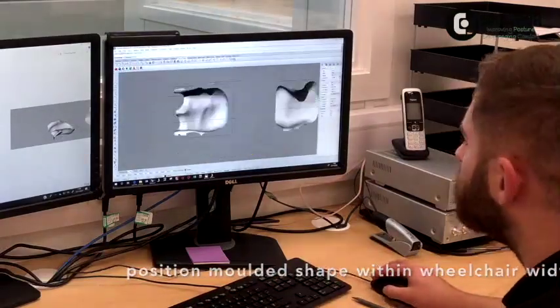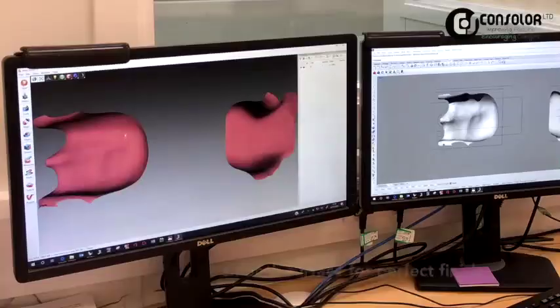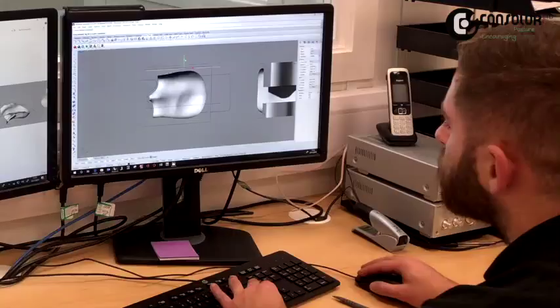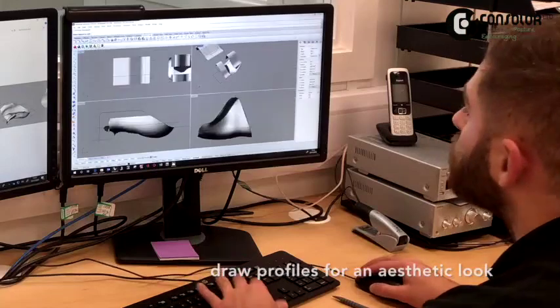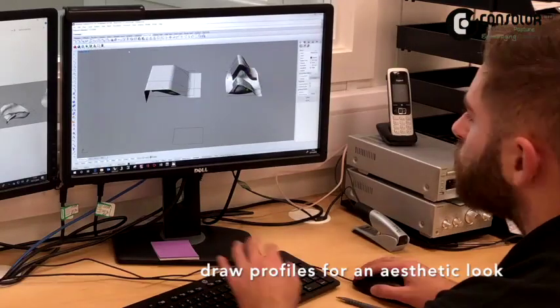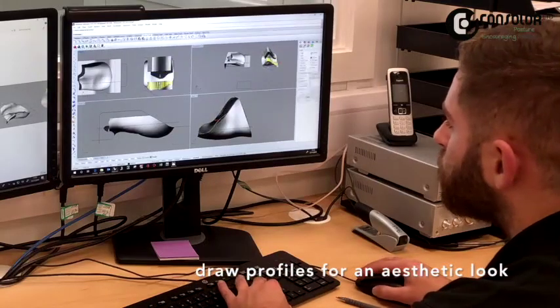Treating them as separate cushions speeds up the robotic carving process and reduces the amount of foam waste. The seat surfaces are smoothed and external profiles finalised to make the seat look as good as possible. How the seat will fit into the wheelchair for size and orientation is also checked.